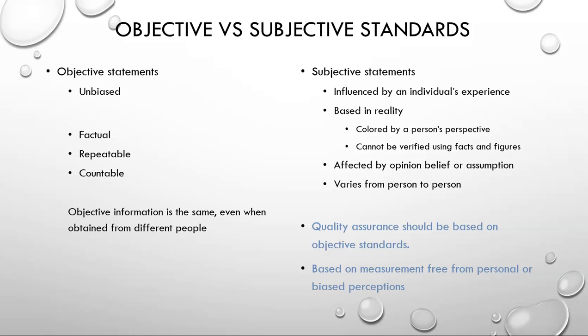Quality assurance should be based on objective standards, and should be based on measurements free of personal or biased perceptions.